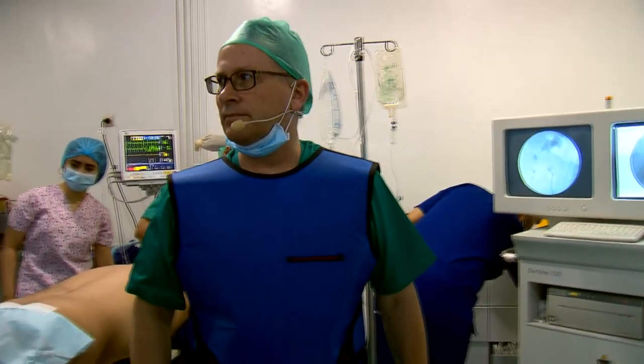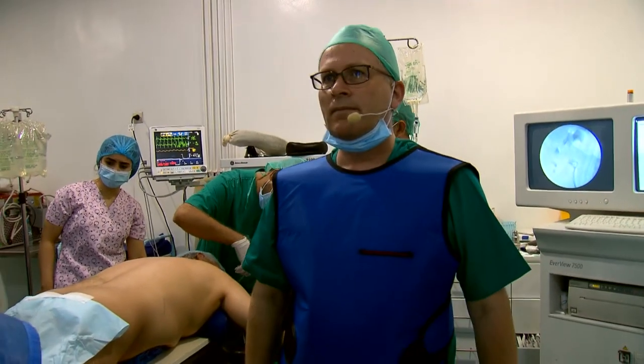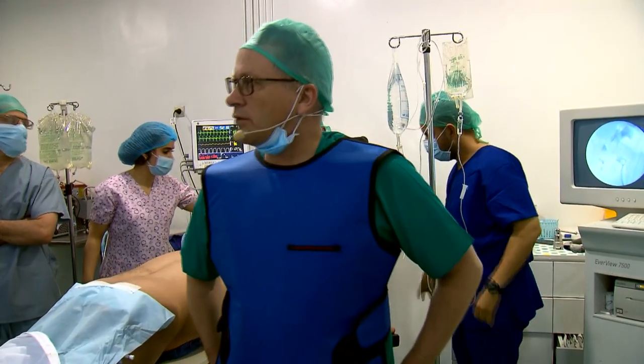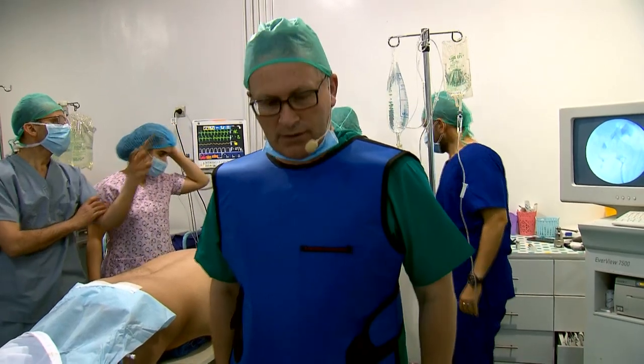Just one question, Mr. Lahme. It's concerning the lower calyx. You know that there are two branches, and can you tell us which one is the anterior and which one is the posterior? I think that is important because the preference is to puncture the posterior calyx. Mr. Gunnar, what is your decision? Would you recommend to puncture the upper part of the two-branched calyx, or what is your opinion? My question is which one is the anterior and which one is the posterior?